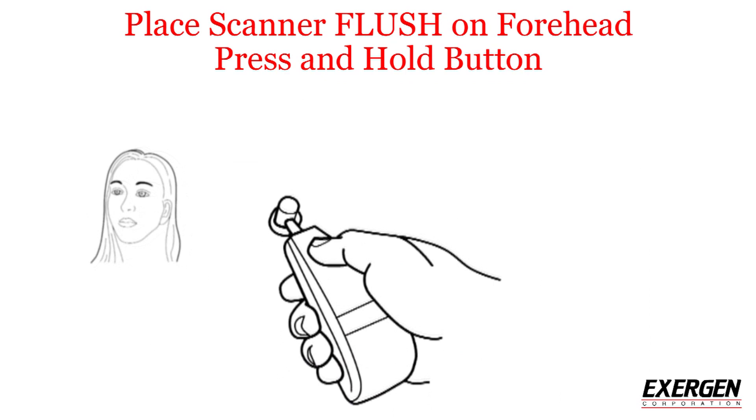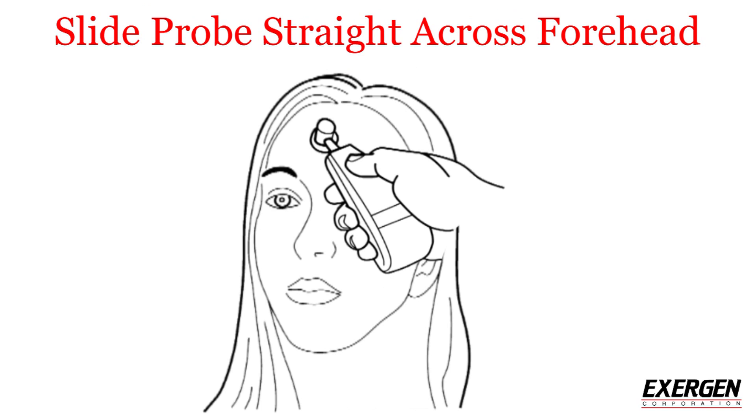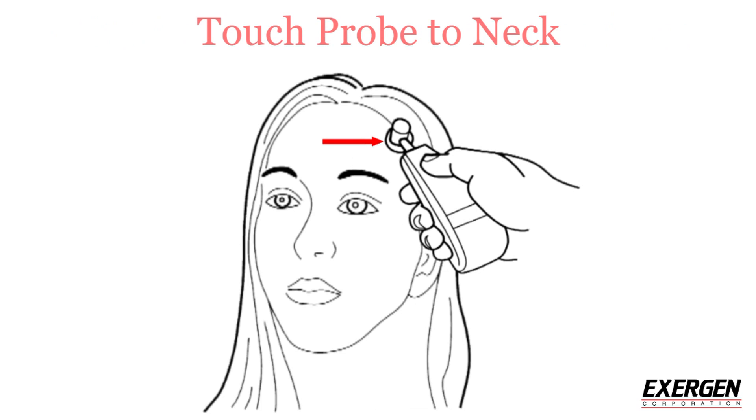Press and hold the button down on the scanner and keep it pressed until you are done. It is important that the probe is fully flush against the skin. With the button still pressed down, slide the probe across the forehead only — not down the side of the face.